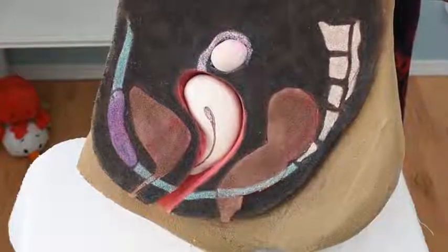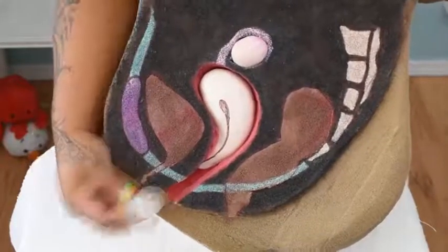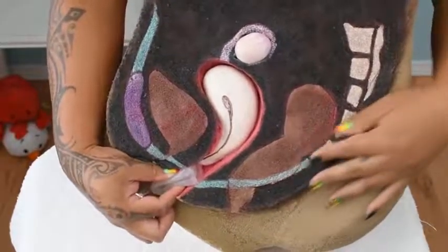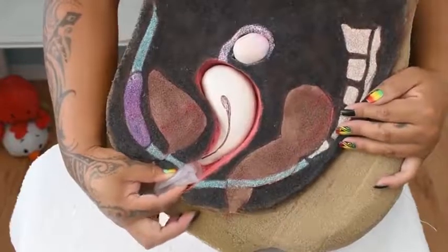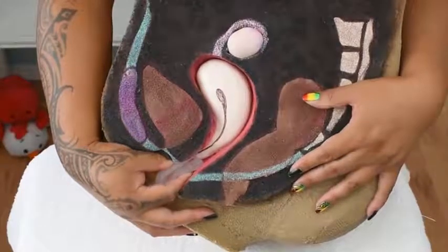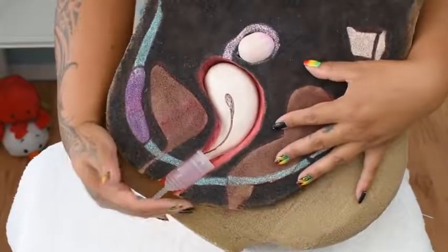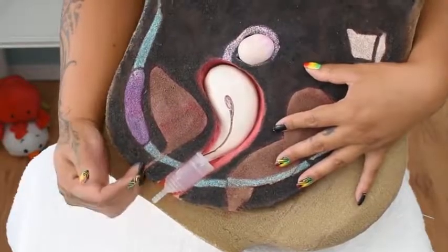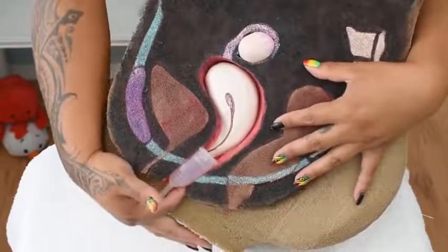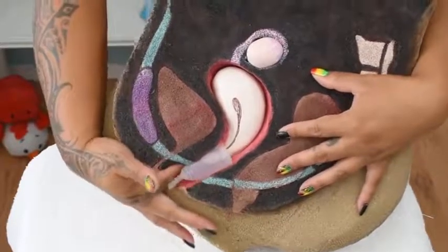Once you're in a comfortable position and you've found the fold you want to use, gently spread your labia and insert your menstrual cup aiming toward the tailbone until your hand is resting against your body. At this point, you can release the cup. The cup might not be fully in position and you might have some of it partially outside of your body. You can use a finger to maneuver the cup into place using the rim as leverage and support.